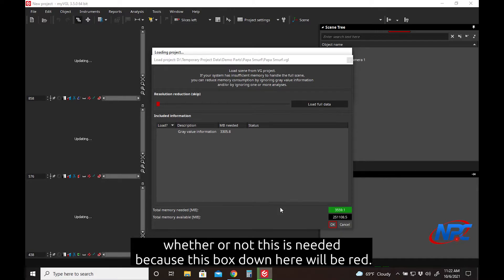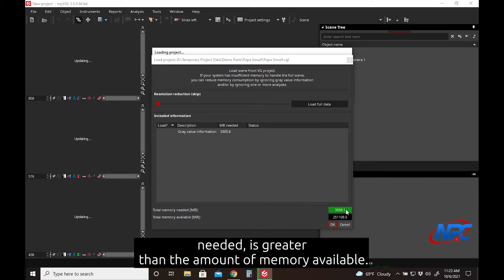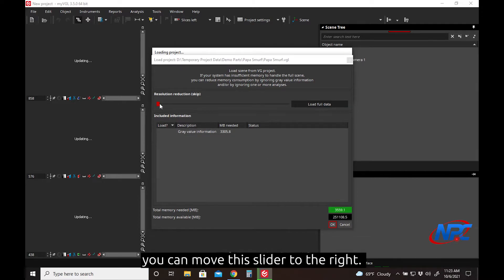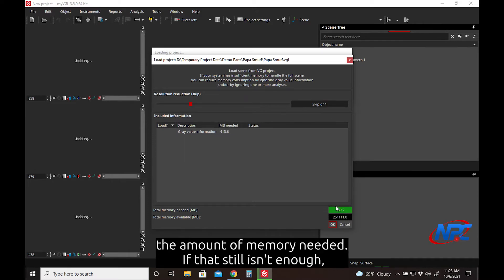You'll be able to tell whether or not this is needed because this box down here will be red, and that will be telling you that this top number, the amount of memory needed, is greater than the amount of memory available. So in that case, if that box were to be red, you can move this slider to the right, and here we are at skip of 1, and it has greatly reduced the amount of memory needed.